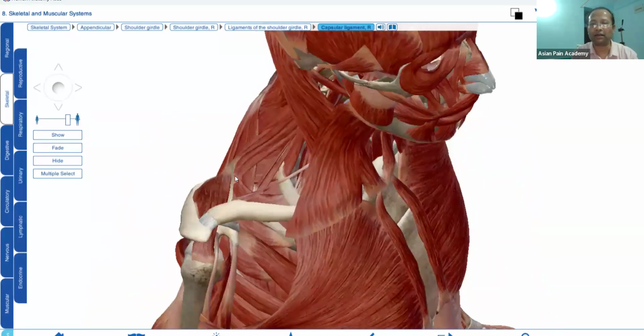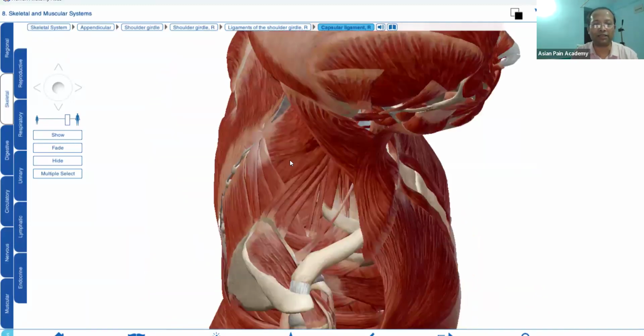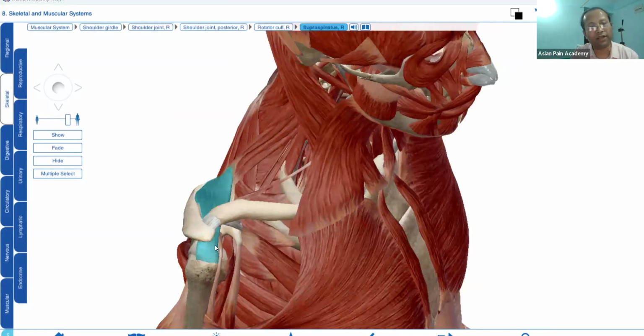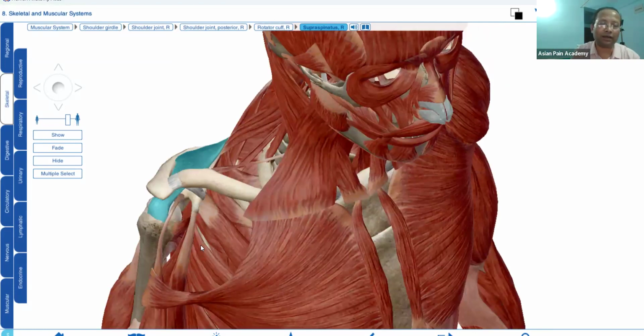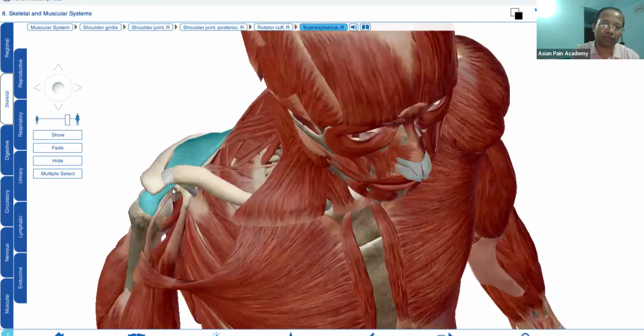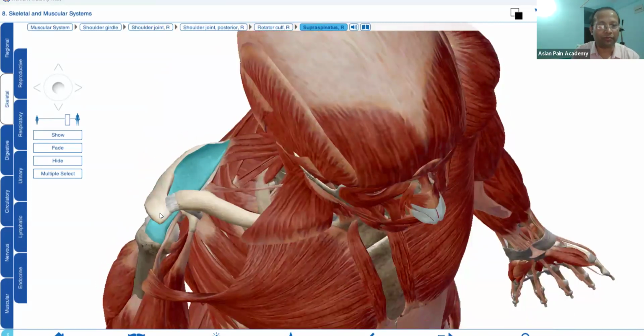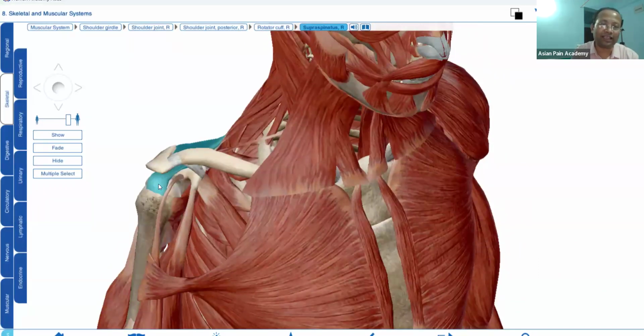Okay. So here you see one thing, that this supraspinatus tendon is the major source of many types of rotator cuff tendinopathy, not all, but this is of major importance. So here you see the supraspinatus tendon up to this much, and after that you will be on the bone, the acromion. This is the acromion, and then you will see the tendon here. So there is a possibility that when there is movement, this tendon and bone can rub each other.